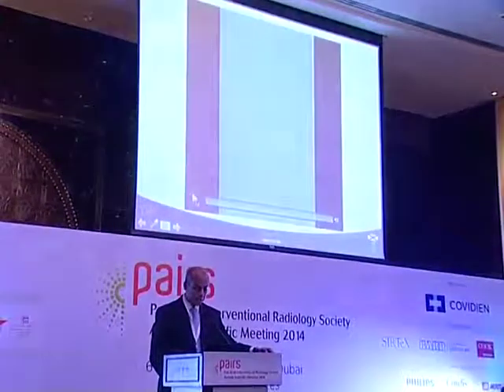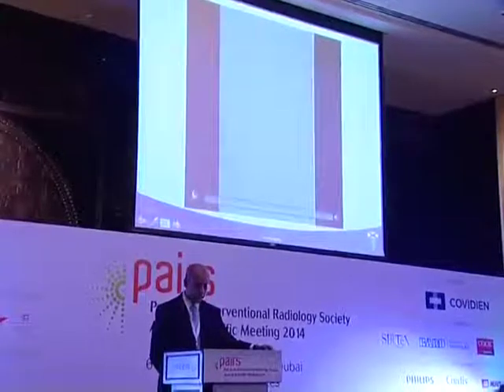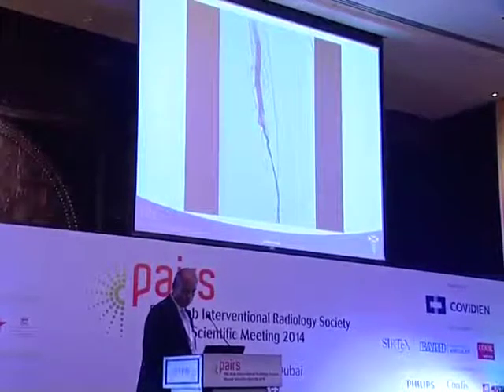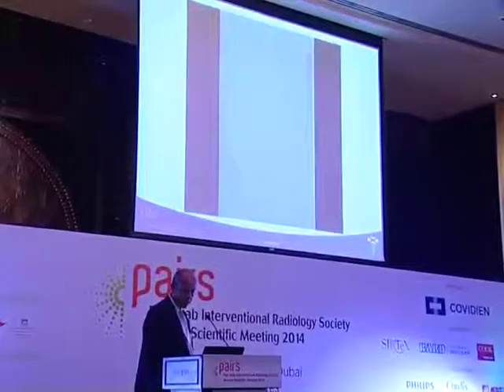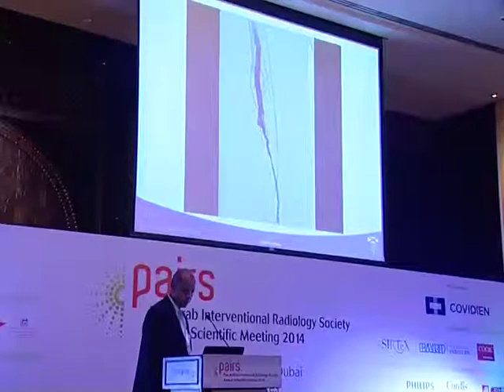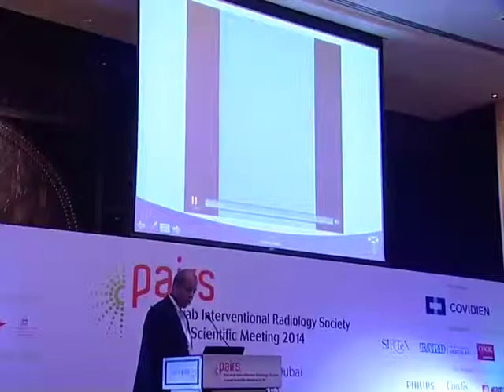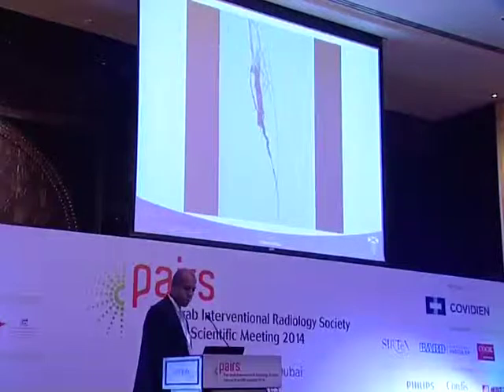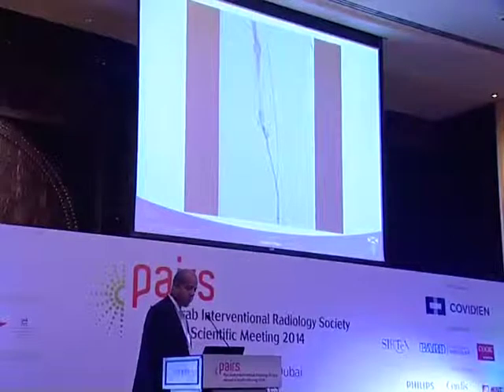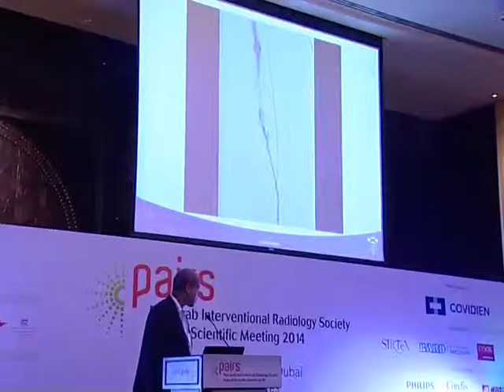After the patient underwent a percutaneous approach and was not getting any better. Oh, did I miss one slide? So here is the angiogram. So the patient gets an angioplasty and stent, but is not getting any better, and the patient is referred to us. So this is the post-angioplasty. Yeah, several weeks, months, maybe in between, the SFA stent that you can see here in the proximal segment. And the hope originally was just that by fixing the inflow, he will get better, but he didn't. So because of that, he was taken again to the angio suite, and this is the angiogram.